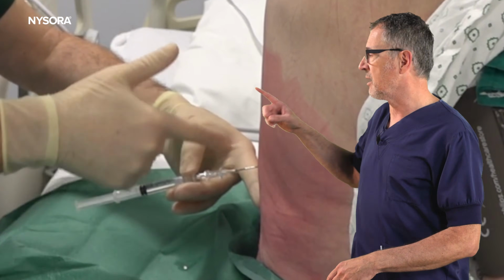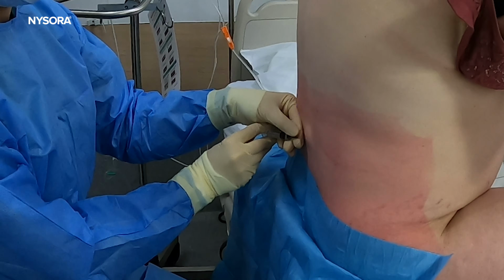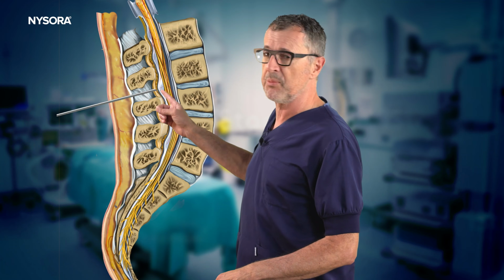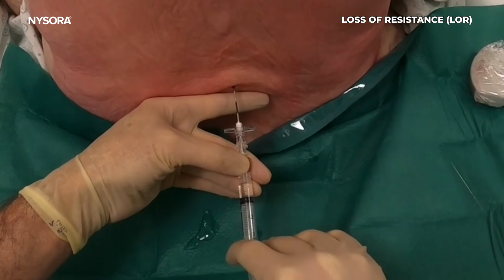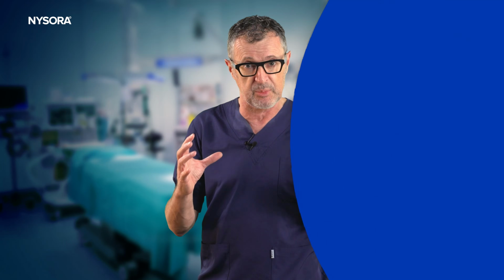Epidural anesthesia is a commonly used technique in medical practice for providing pain relief during labor, surgery, and other medical procedures. It involves the injection of local anesthetic or medication into the epidural space, which is the area surrounding the spinal cord. The success and the safety of epidural anesthesia really depends on accurate identification of the epidural space, which is traditionally done using the loss of resistance technique based on the operator's feel, but not on objective measuring of that pressure change.